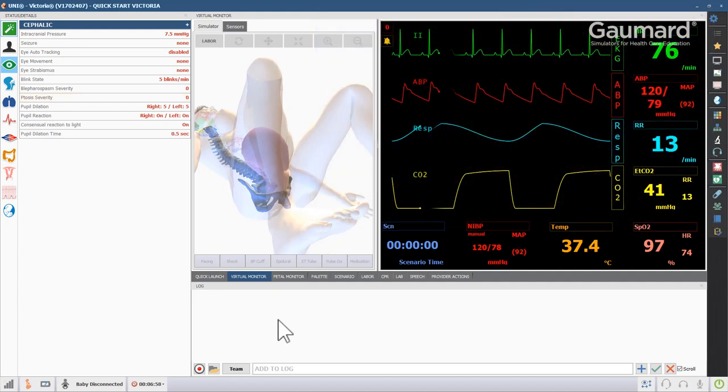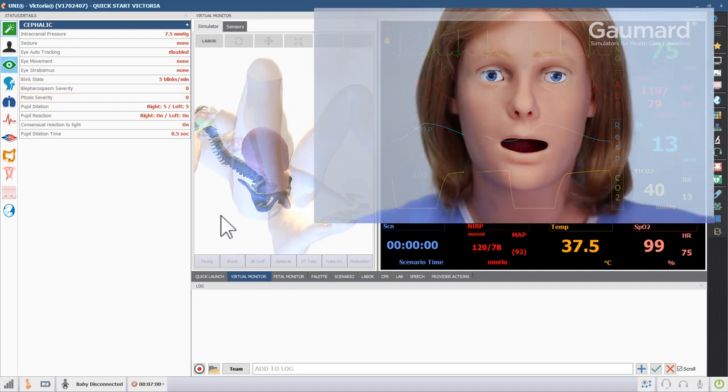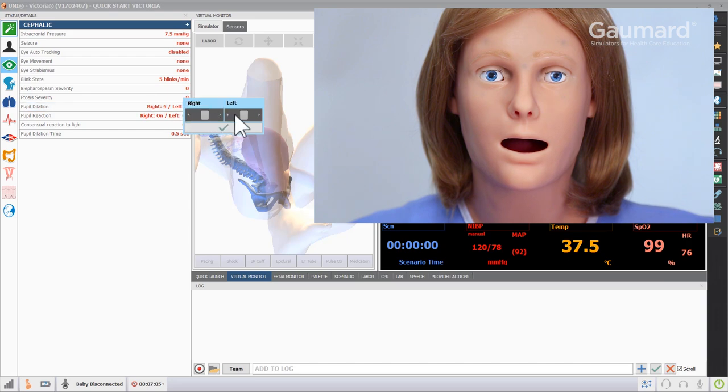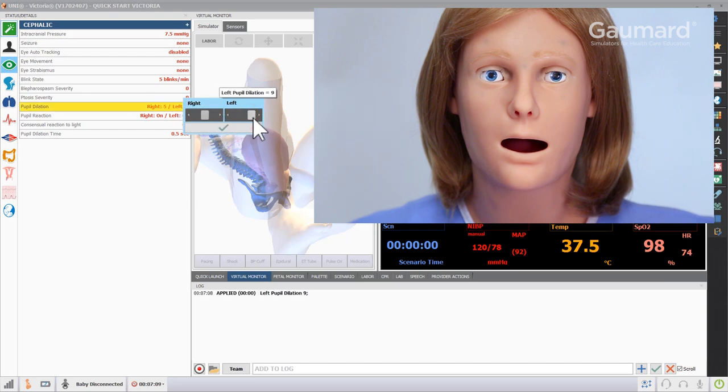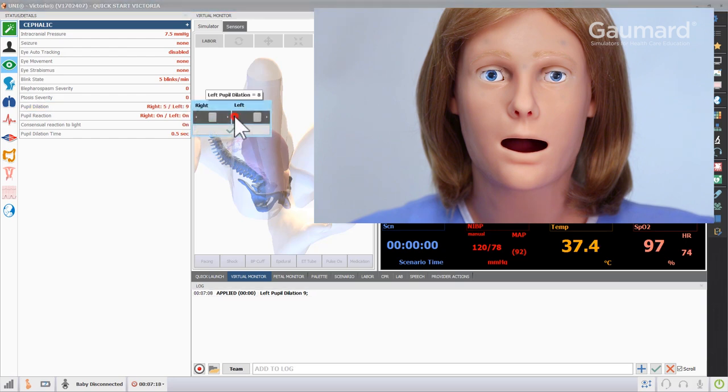You can control the constriction and dilation of Victoria's pupils by adjusting the values next to pupil dilation. Moving the slider to the right will dilate the eye. Moving the slider to the left will constrict the eye.